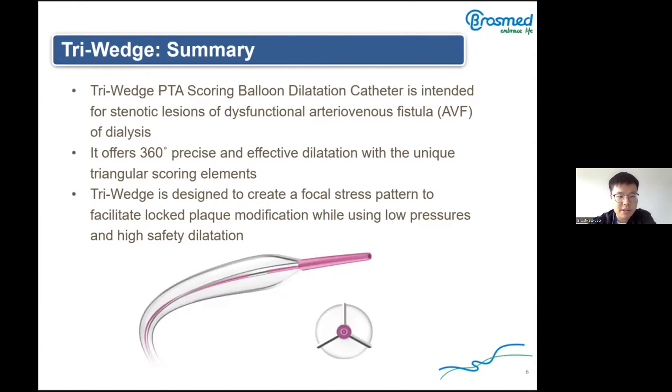Triwitch is designed to create a focal stress pattern to facilitate local plaque modification while using low pressure and high safety. During balloon dilatation, the balloon squeezes the scoring element, and the scoring element squeezes the lesion, so we can use low pressure to achieve high stress.